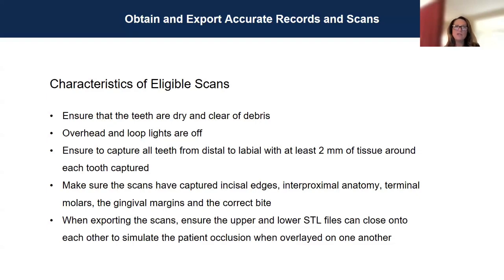Get those teeth brushed before you start doing your records. And make sure the patient swallows, air flosses, and then start scanning. I like to use not only air floss with them, I'll have my gauze and I do a gauze sweep so I don't have little tiny bubbles in the pits and fissures.